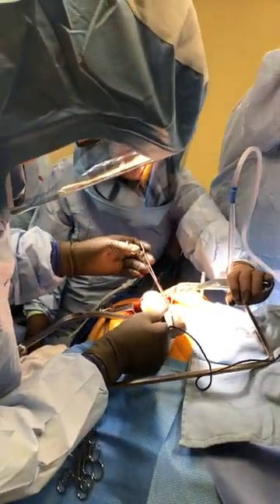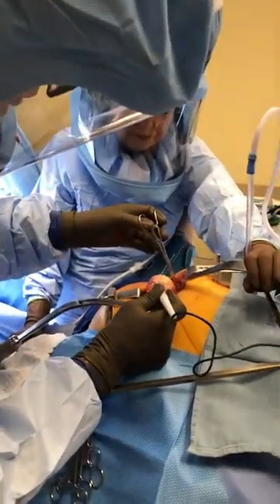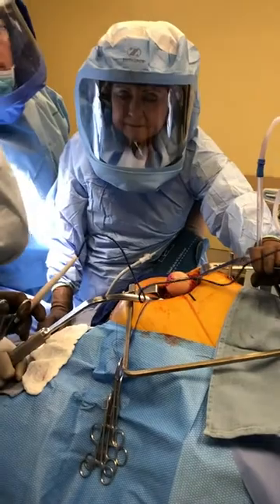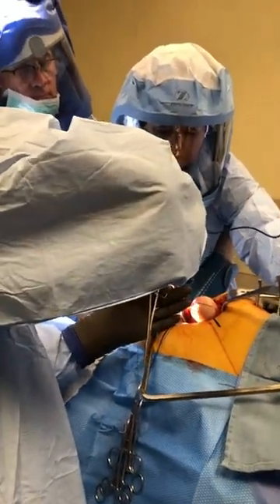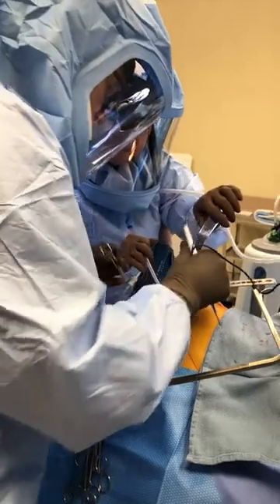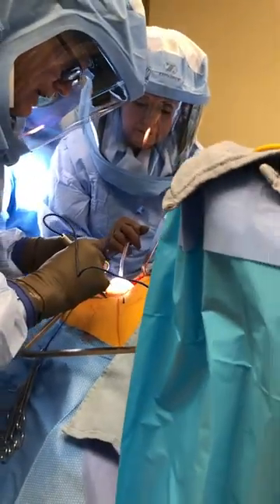So I'm just going to make my coordinate marks on the femur so the head is directly over the neck properly. I'm just extending the neck onto the head, and then I'm going to look at the calcar as well. I can see the calcar and draw the calcar line up, and then we're just going to look at the femoral neck and draw a line where the stem should be if I was looking at an x-ray.